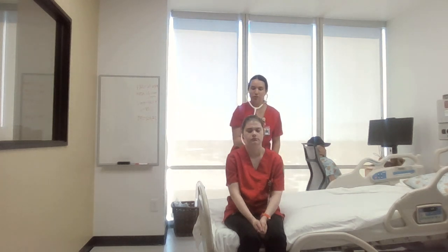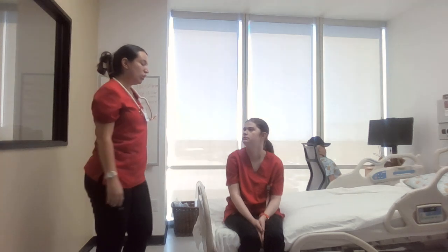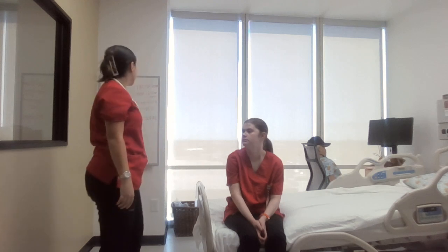And then I would do the bell side for any adventitious sounds as well. Okay, so all lung fields are clear and there were no adventitious sounds present on auscultation. Next, I'm going to do the cardiac assessment. So the first thing I'll do is reverbalize what I got during vitals.